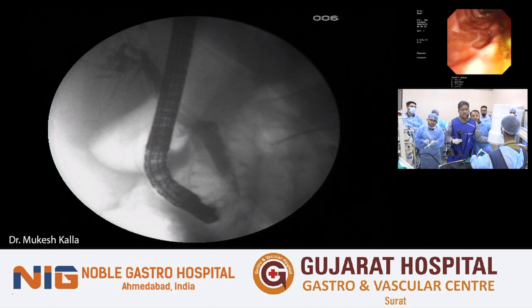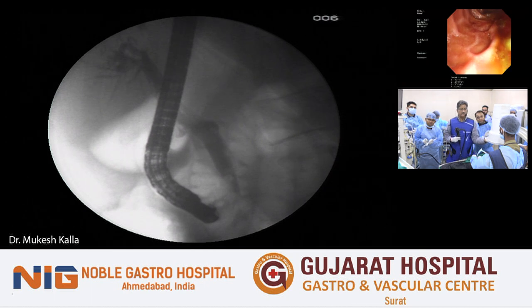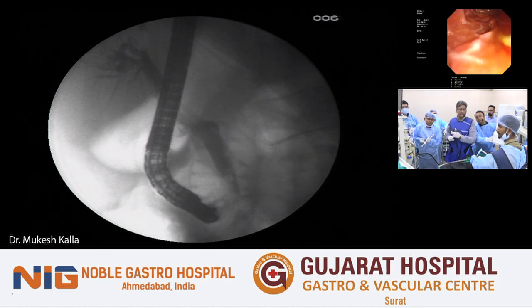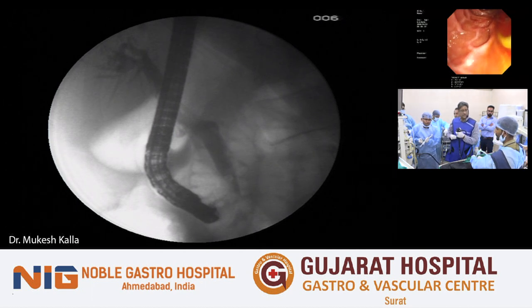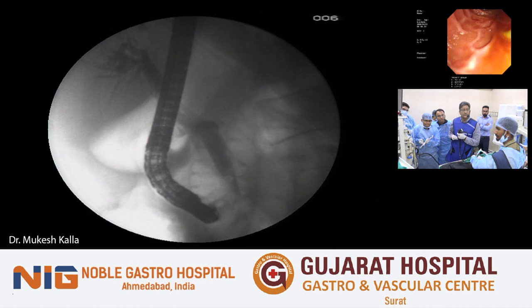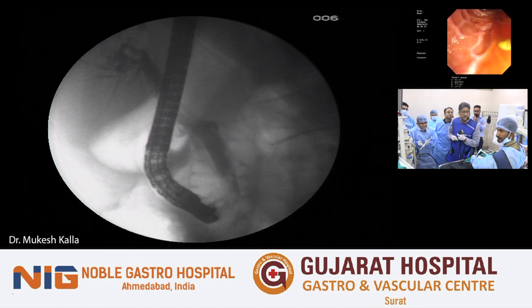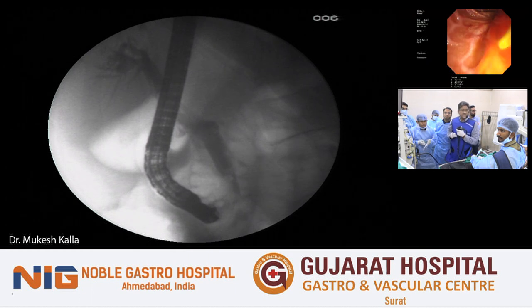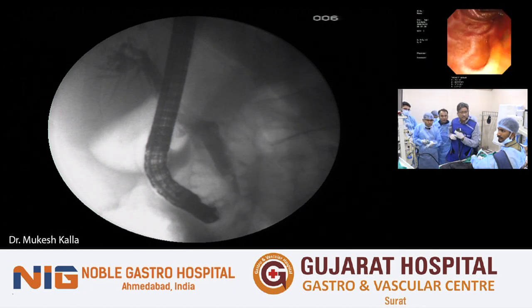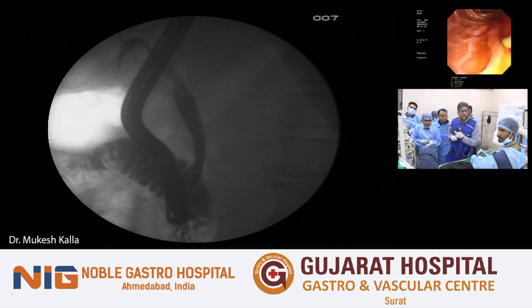Fluoro on, please. Contrast dalo. Wonderful. Fluoro dikhao. To me, it looks like the cystic duct is very neatly cut. We did not have a picture of the IITV. It is there now.